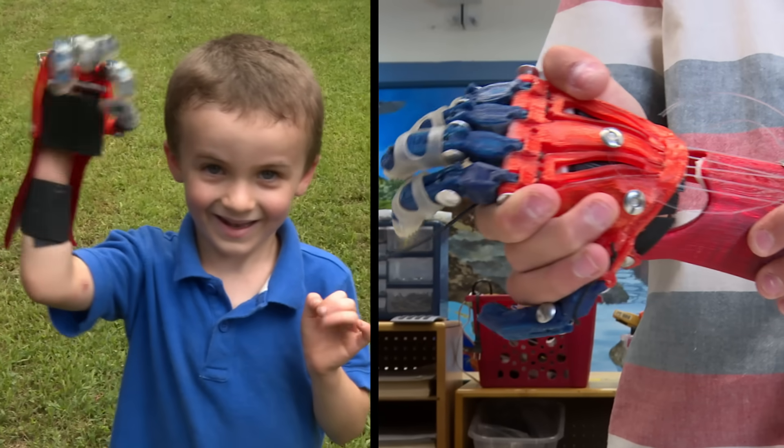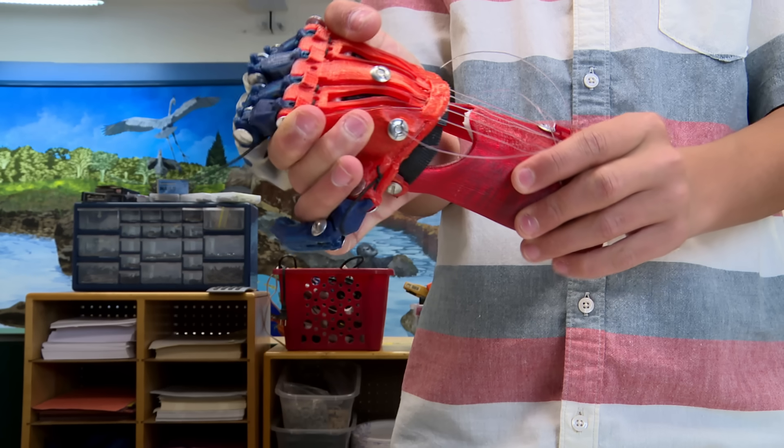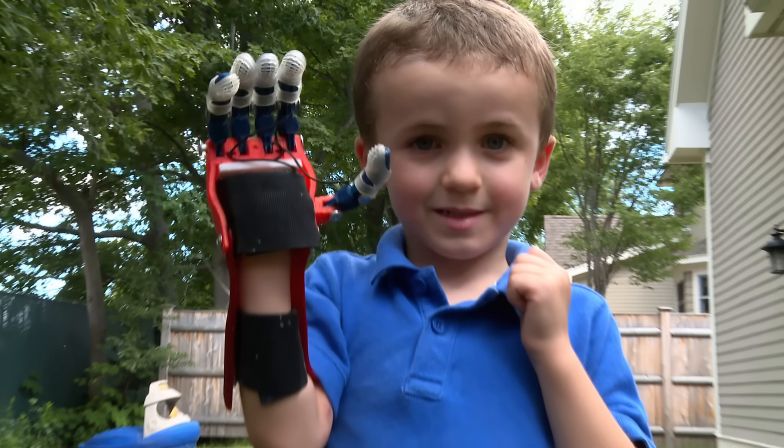Here's how the Cyborg Beast works. When Max bends his wrist down, the fingers come down too because they're being pulled. And when Max returns his wrist to a straight position, the fingers open up and go back to normal. But here's the problem — the Cyborg Beast takes a lot of forearm strength to make it move. It's tough to push down, so it's hard for a kid Max's age to use it for a long period of time.